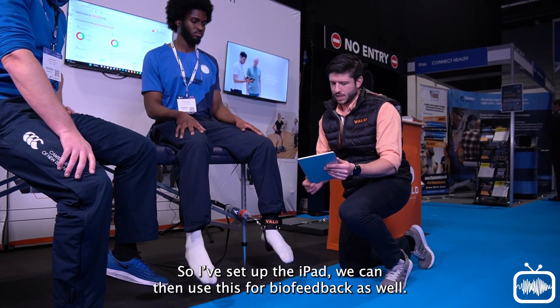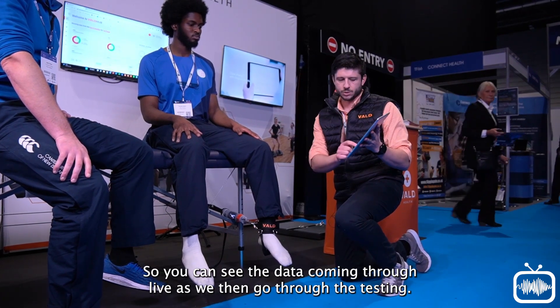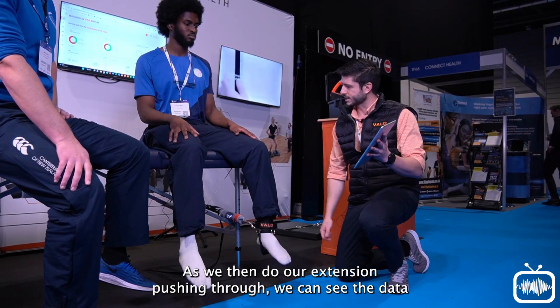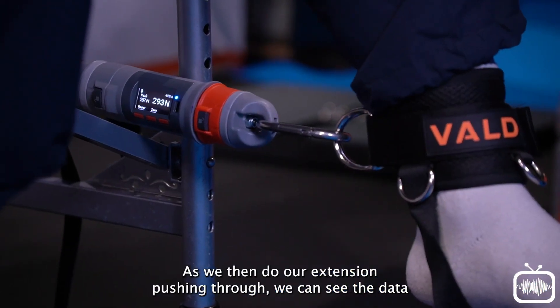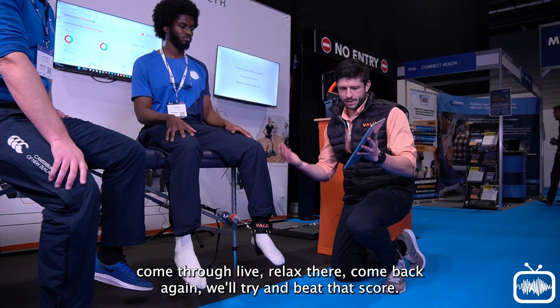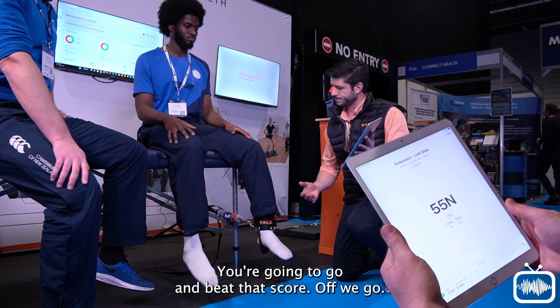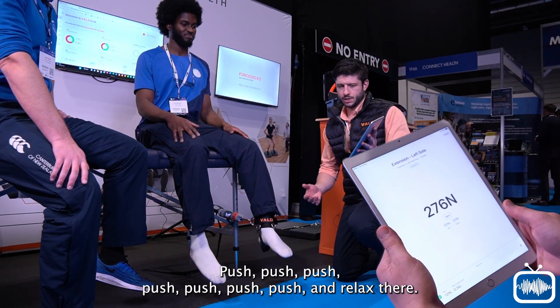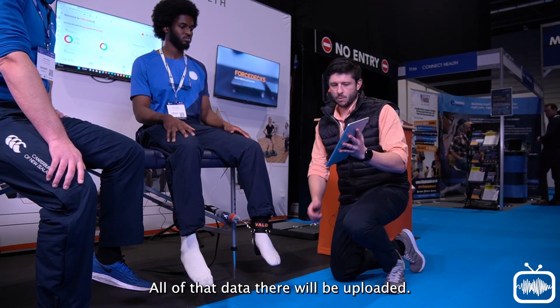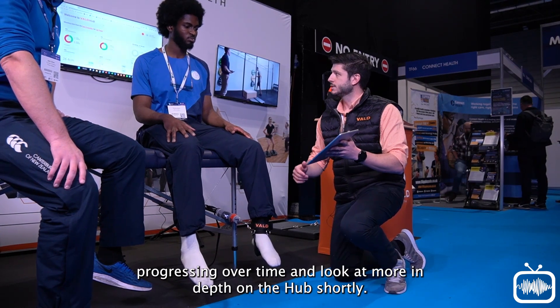I've set up the iPad — we can use this for biofeedback as well, seeing the data come through live as we go through testing. We've set the angle we want, and as we then do the extension, pushing through, we can see the data come through live. We'll relax, come back again, and try to beat that score. We can see the previous score, so off we go — push — and relax. All of that data will be uploaded so we can see how the patient is progressing over time.